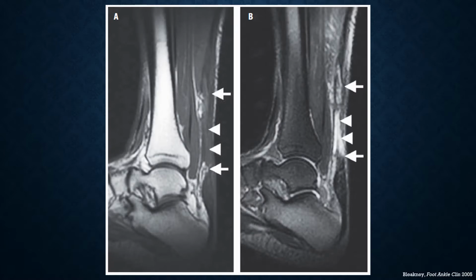We've been talking so far a lot about Achilles tendinopathy, but I thought I would touch on imaging for an Achilles tendon rupture. For a suspected full-thickness tendon rupture, ultrasound is not typically used in the clinic because the field of view can be a little limited and it can be difficult to investigate any other potential pathologies, since ruptures typically occur in a more traumatic setting. Sometimes sports medicine clinicians may use a portable ultrasound unit on the sideline since it's fast and easy. But even then, the patient will typically undergo an MRI as soon as possible in the clinic.